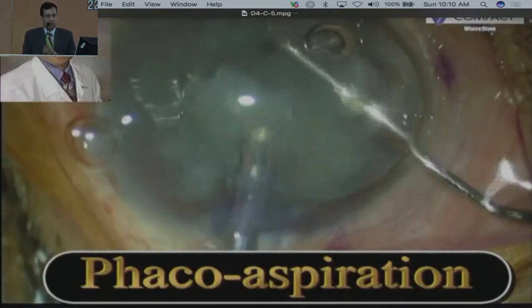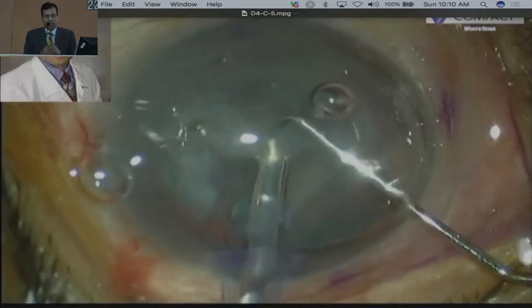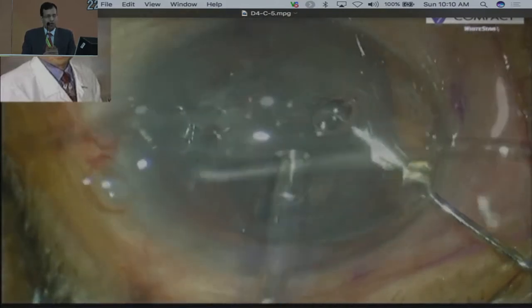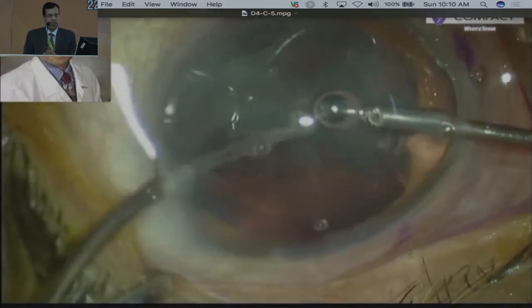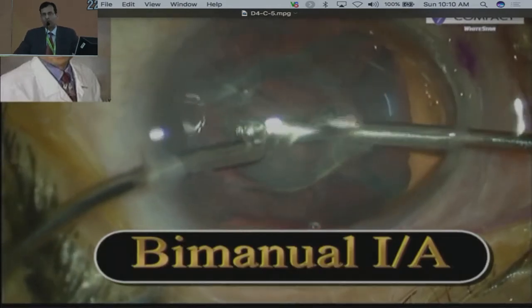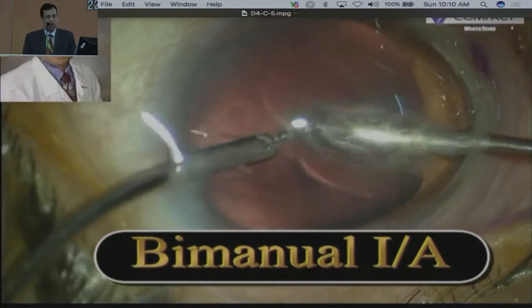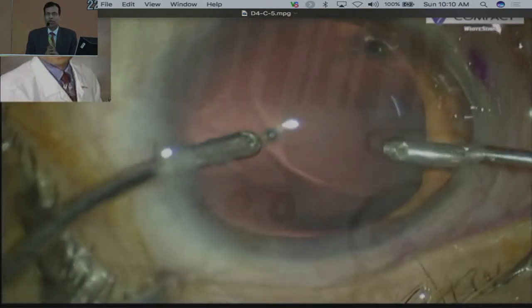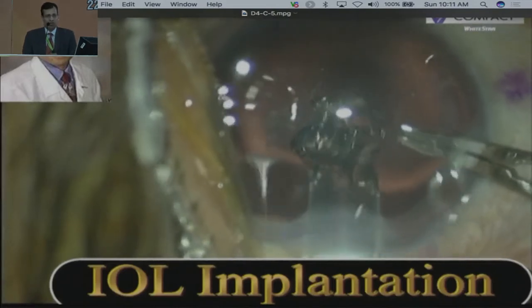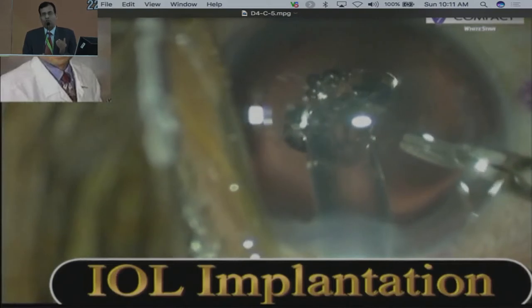Whenever you implant a TORIC lens in such unusual situations, always cross-check the K-reading with two different instruments. I have a Sirius Pentacam system and also use topography and the IOLMaster to cross-check the K-reading. The capsulorrhexis should be done precisely at 5 to 5.25 millimeters in size. I use dispersive OVD — chondroitin sulfate-based OVD — in all my cases. Phacoemulsification and cortical cleanup should be done precisely and perfectly. You can see the lens optic size is 6.25 millimeters. For myopic eyes with large pupils, Rayner makes the optic slightly larger.